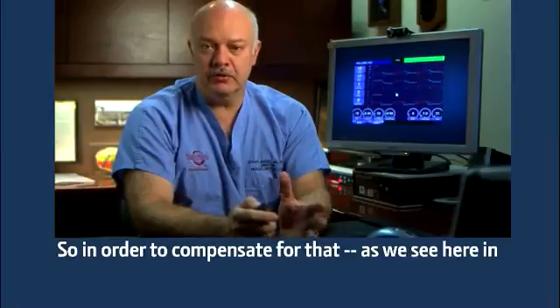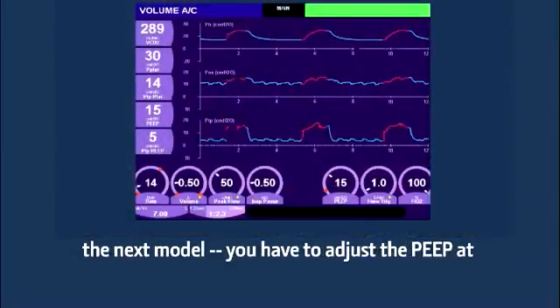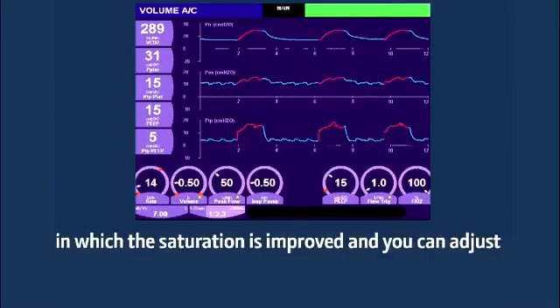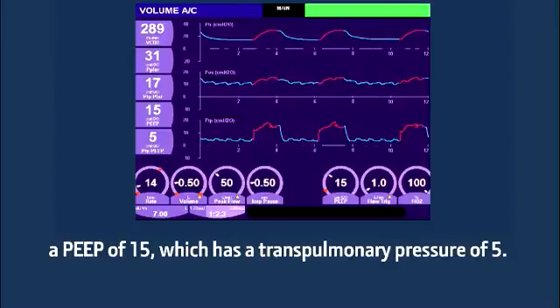So in order to compensate for that, as we see here in the next model, you have to adjust the PEEP in increments until you eventually get the desired effect in which the saturations improve and you can adjust your FiO2 as well. In this example, we have reached a PEEP of 15, which has a transpulmonary pressure of 5.